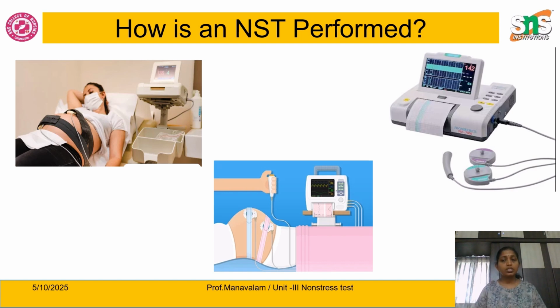Next we have to instruct the mother to press the event marker, that is a finger-like probe. We have the mother press that marker whenever she feels fetal movement. So everything will be traced out on the graph sheet.